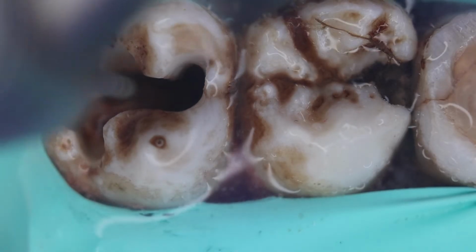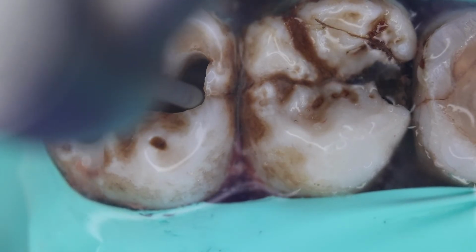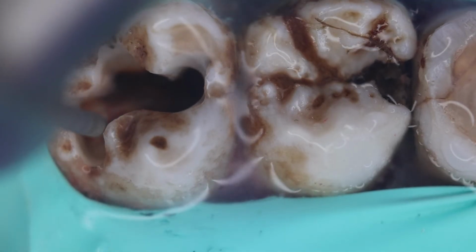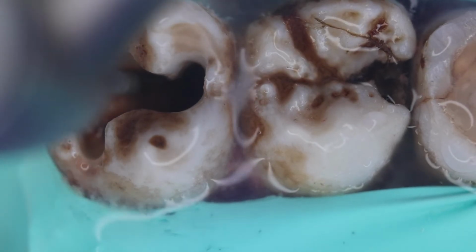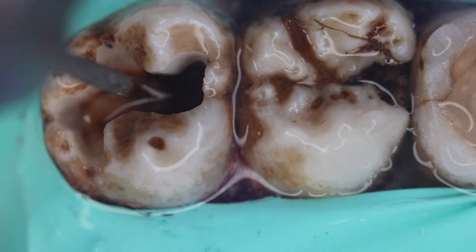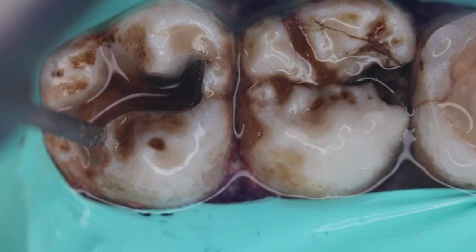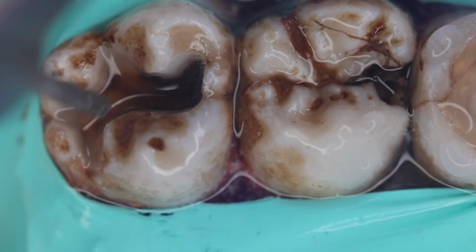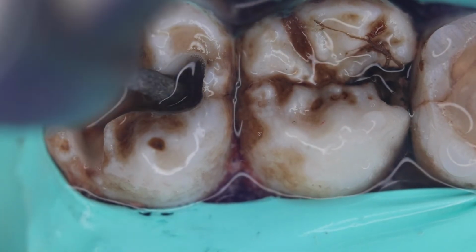See, now we are just rounding off the margins, or we can say the cavosurface margins where the restoration would be. And why this rounding off is important is because we need the resistance form, so that the restoration that is integrating with the tooth should not wear off once the occlusal forces are established.